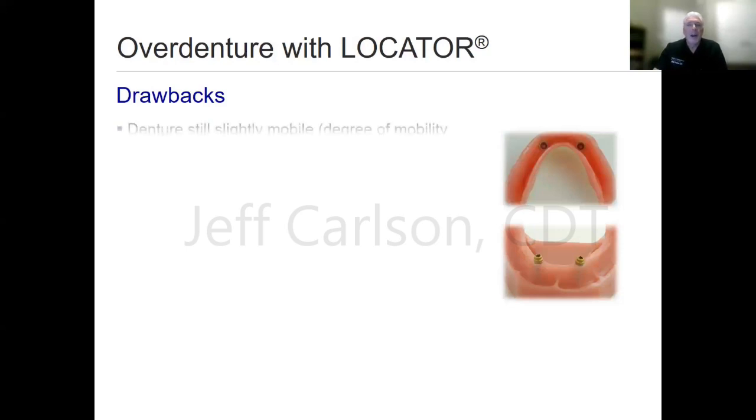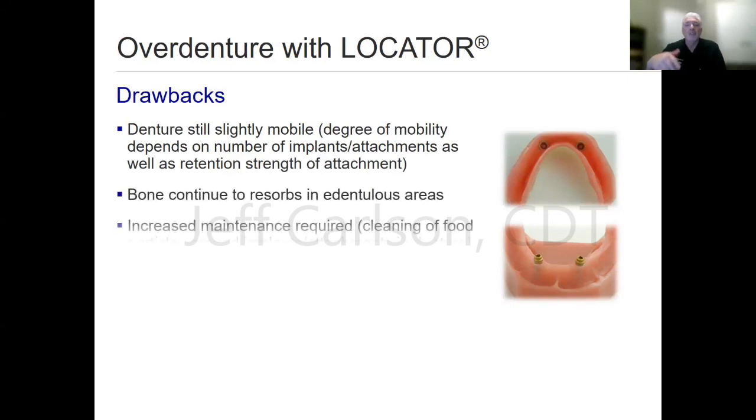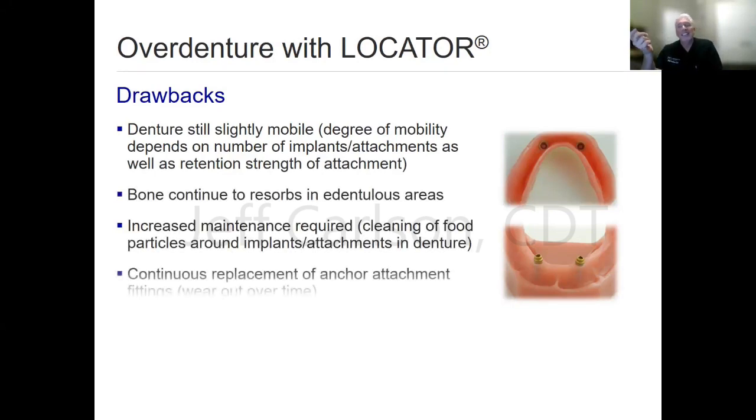Some drawbacks: like I mentioned, you're going to have the mobility, and you still have to do a reline. I think you all are aware of this, a reline doesn't mean that it's the prosthesis, the intaglio side of the prosthesis, wearing. Relines are done because the bone is resorbed. So keep in mind that the patient's still going to need that. A lot of them think, oh, I got my implants, I never need to come here and see you again. So relining the implant prosthesis, it depends patient by patient, but just be aware that it will definitely need to be relined.